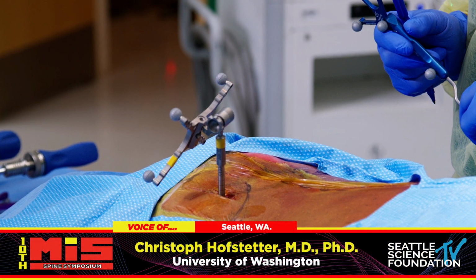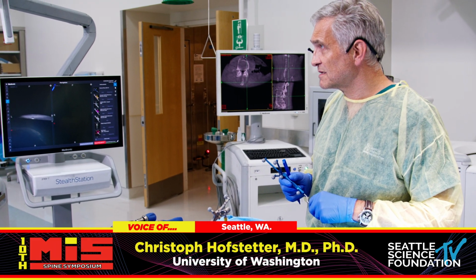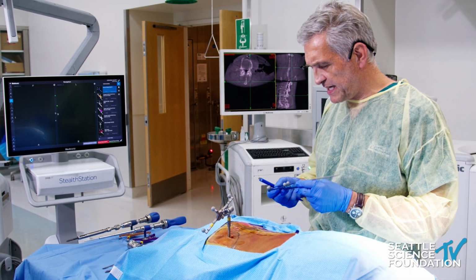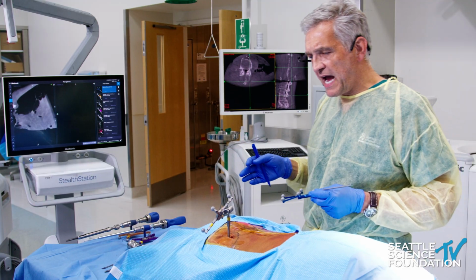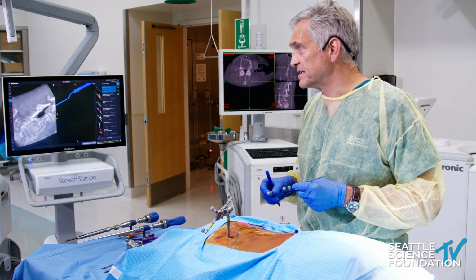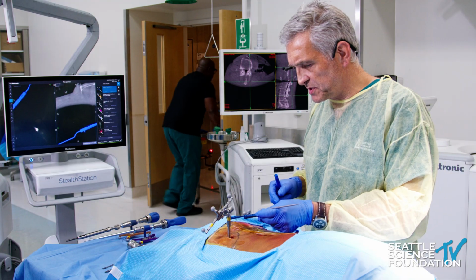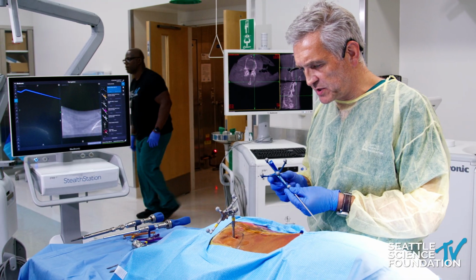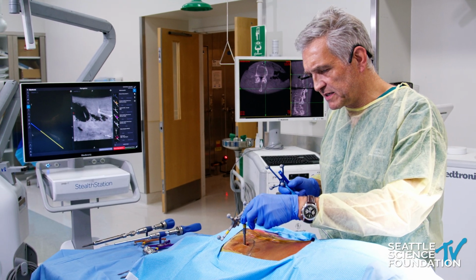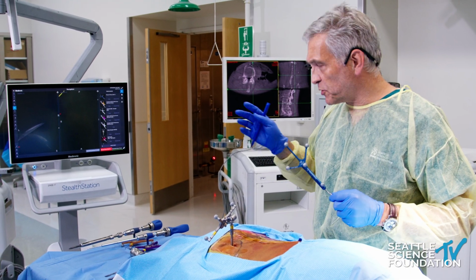And Roger, one thing is, for non-instrumented cases, you just basically tape the reference array onto the skin, right? Yes, I showed that earlier. So for a case where we don't put in screws, where you can tolerate maybe 1 or 2 millimeters of inaccuracy, then I just tape the reference array to the skin, exactly like I showed earlier. But obviously for pedicle screws, we want to make sure everything is very, very stable, which it is here. And then I start with putting in the pedicle screws.